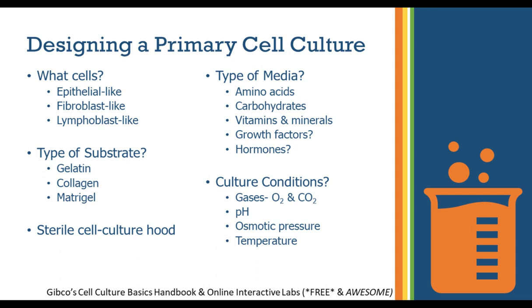You also need to know the type of substrate, whether they can just sit on the plastic petri dishes or if you need gelatin, collagen, or Matrigel. You also have to use sterile conditions when you're using your cell culture to prevent bacterial and fungal contamination, which can completely ruin your culture.